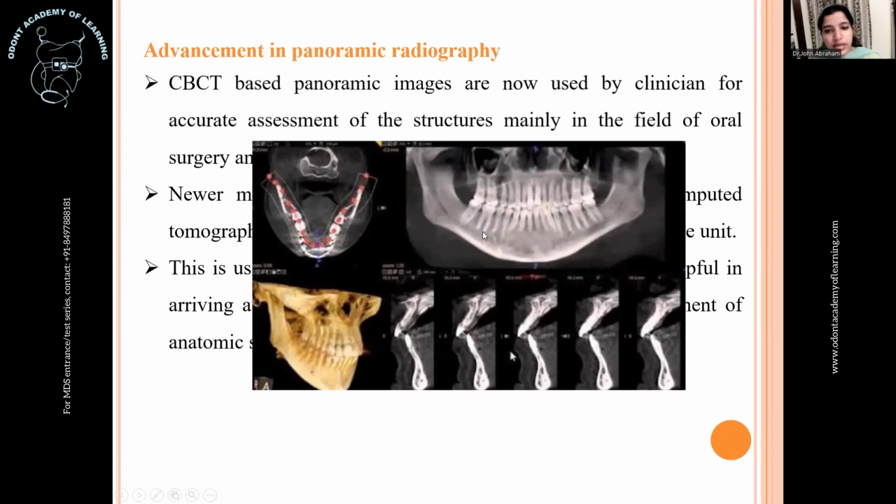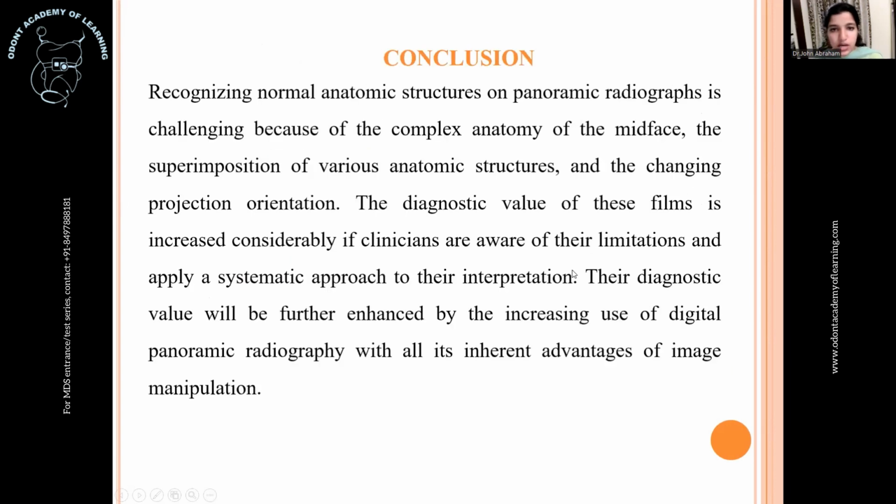So if it is a case of a cyst or tumor or anything, you can find the exact location in all three dimensions with the help of CBCT, with the panoramic image construction and the 3D reconstruction. So that is the advancement.